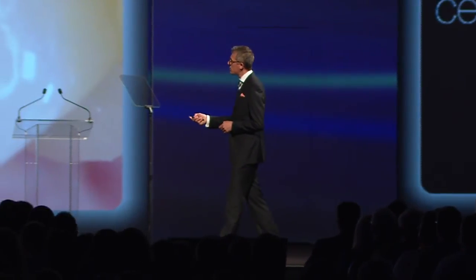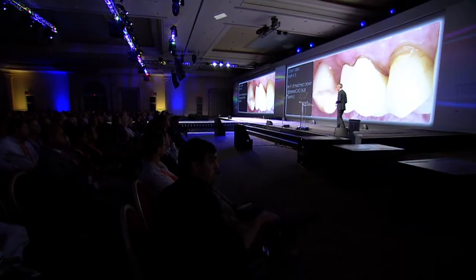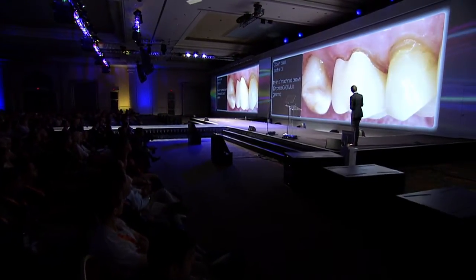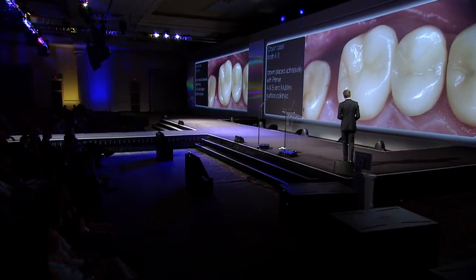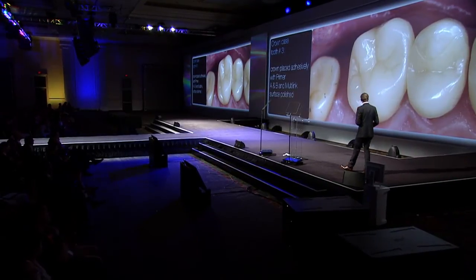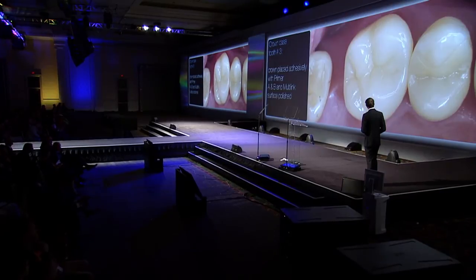In this case, I used the multi-block, the Empress CAD multi-block by the Ivoclar company. And again, a very nice fit of our crown margin in relation to our preparation. Then we can place the restoration, again placed with Multilink and Primer A and B, and this is after the polishing procedure of our ceramic surface.